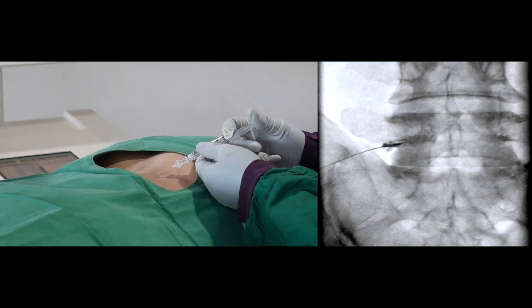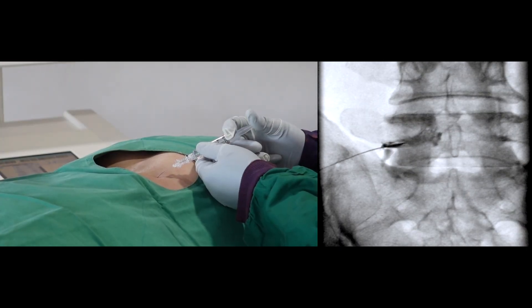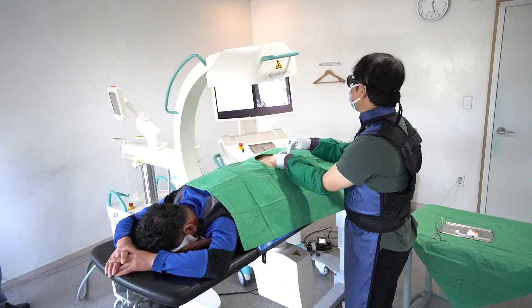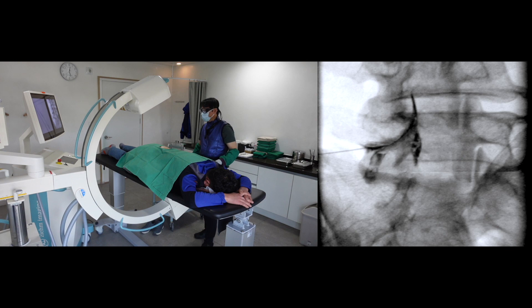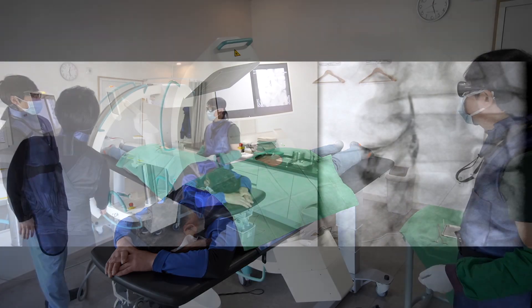If my needle is placed in the right place, the contrast spreads to the transforaminal and epidural space. Keep this image in mind in the Contralateral Oblique image.